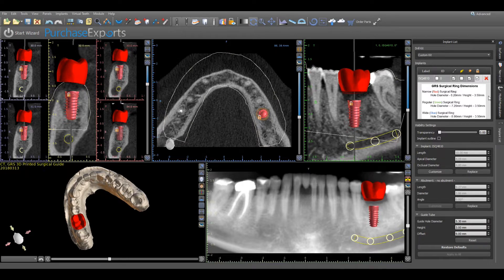Dimensions for all three different sized GRS surgical rings have been provided under the implant subheading for this video and are available at GRSGuideSystem.com. For this video, we will be using the dimensions for the regular GRS surgical ring, and both dimensions for the guide hole diameter and height are simply entered in their respective locations under the guide tube subheading.